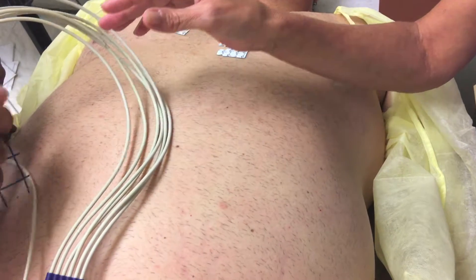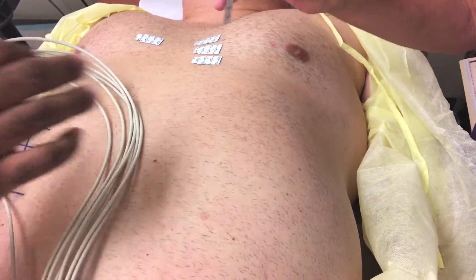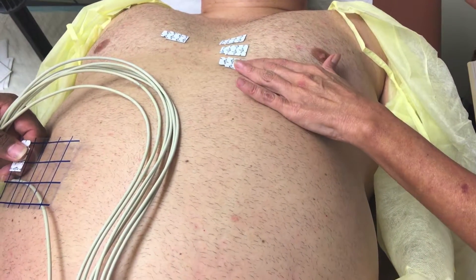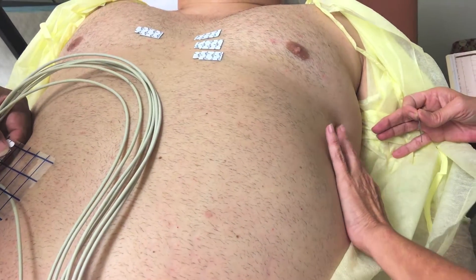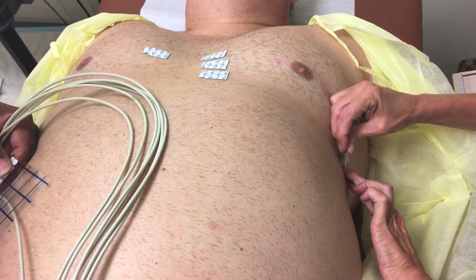V5 goes at the anterior axillary line on the same horizontal level as V4 — but it's going to go down here, more towards the armpit.